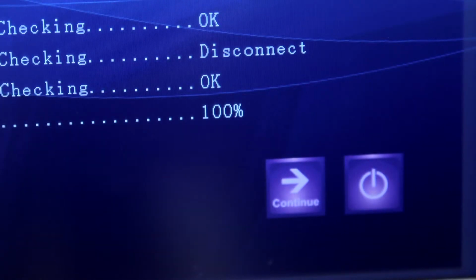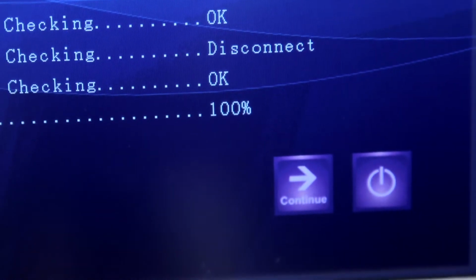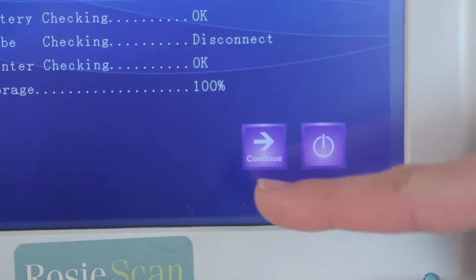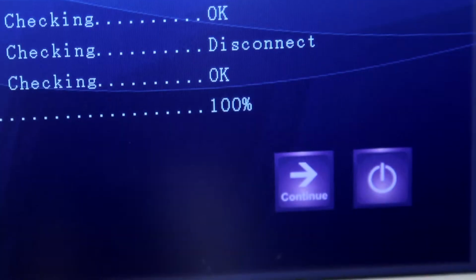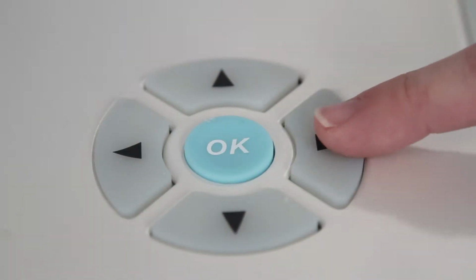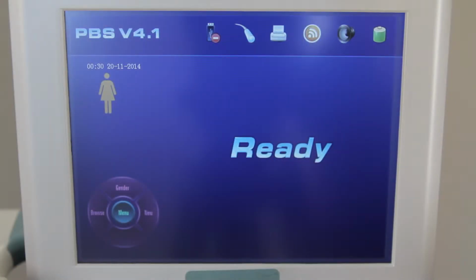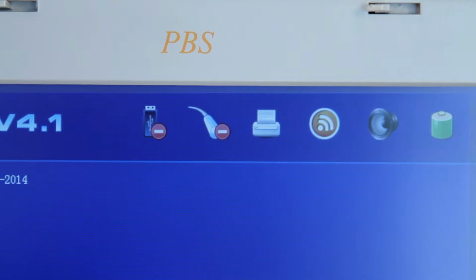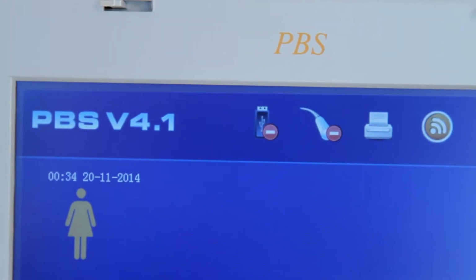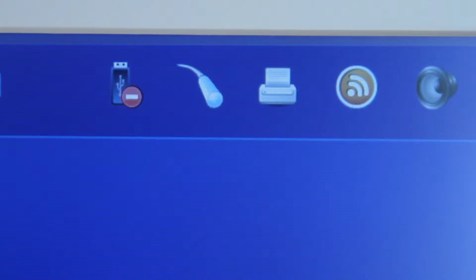At the bottom right corner of the Power On screen, there will be 2 functional keys, Continue and Power. The Continue functional key displays when self-checking fails, so touch the Continue key or press the right directional key in the navigation keys on the control panel to enter the Ready screen of the system. On the top of the Ready screen, you will see a status bar. The icons below may change depending on the device's self-check results.